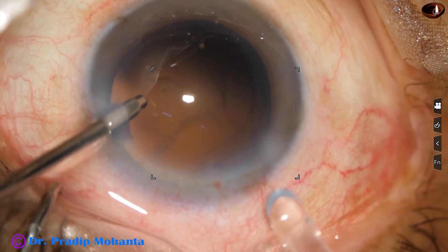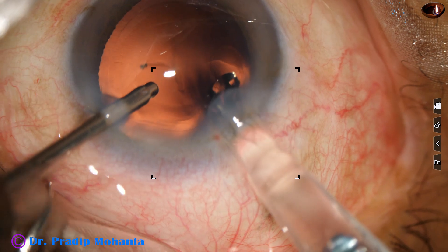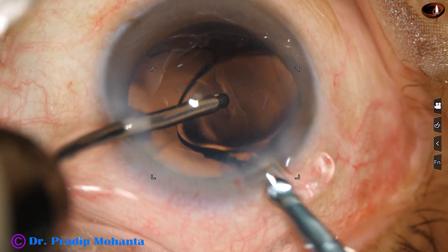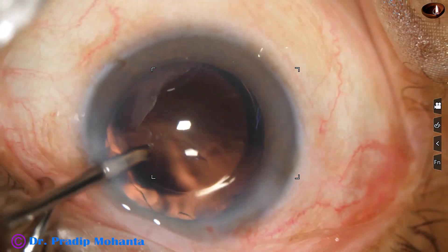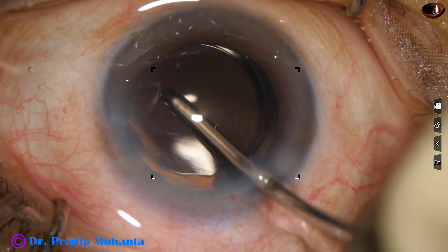Now hydro-implantation of a single-piece monofocal intraocular lens into the capsular bag. By a push of the irrigating probe, the lens is pushed into the capsular bag.